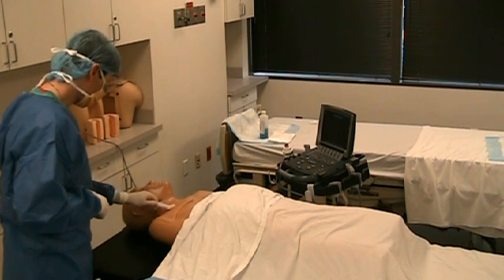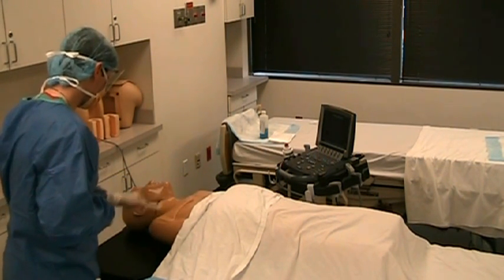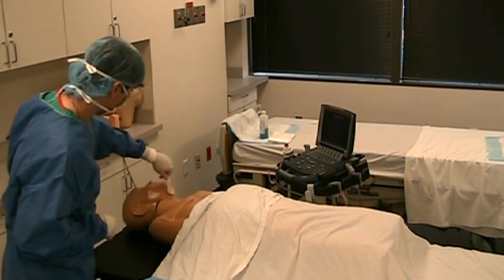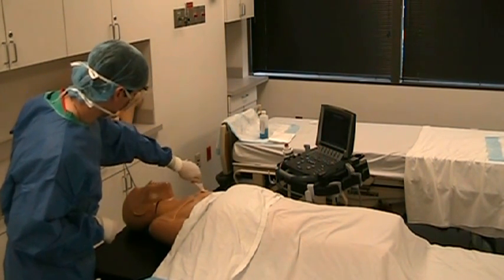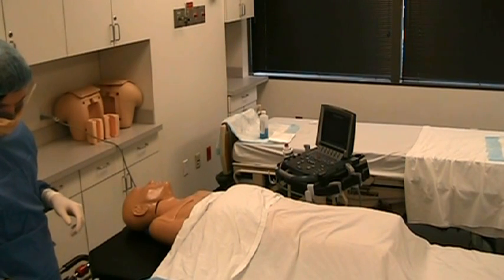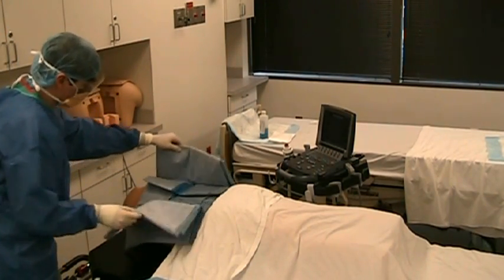The patient's neck and upper chest are sterilely prepped. The thyroid drape is placed over the patient, leaving only the neck and upper chest exposed.